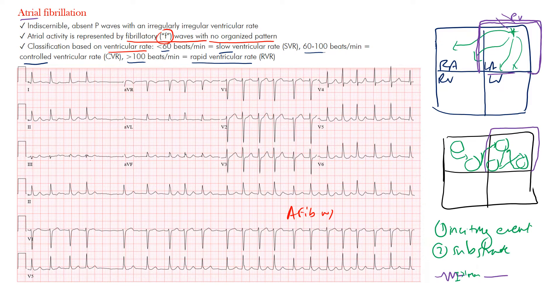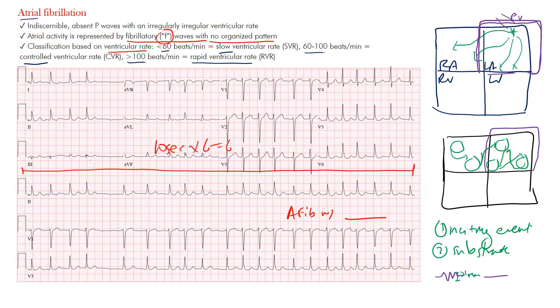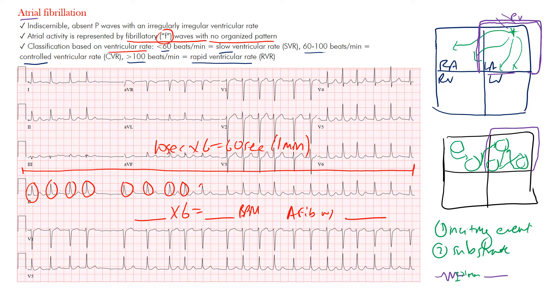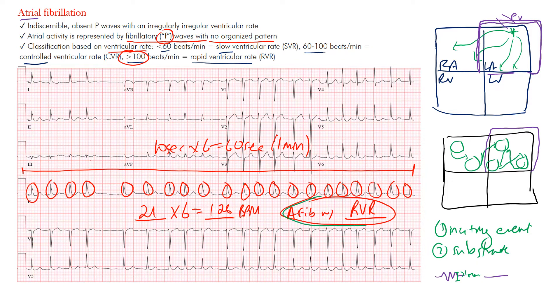We know atrial fibrillation is present — now let's determine the ventricular rate. From beginning to end is 10 seconds on a standard 12-lead EKG, and 10 seconds times 6 equals 60 seconds. Count the number of QRS complexes and multiply by 6. Counting: 1 through 21 complexes. 21 times 6 is 126 — that's over 100 beats per minute. So this is atrial fibrillation with rapid ventricular response, AFib with RVR.